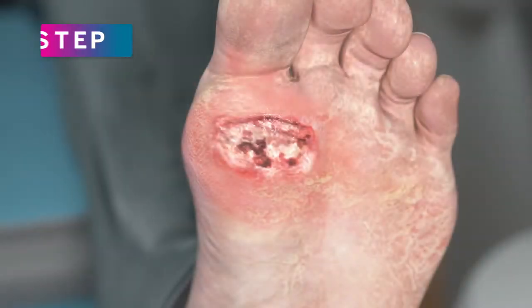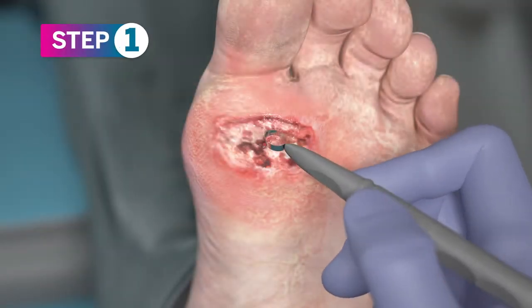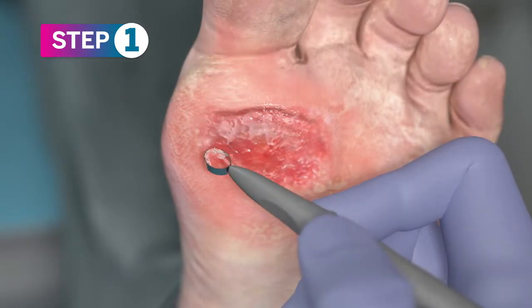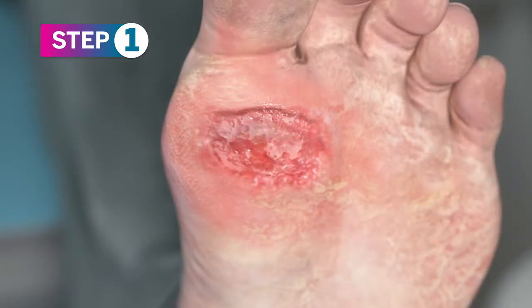It's important to sharply debride the wound, ensuring it is free of debris and necrotic tissue. Make sure the outer rim is flat. Apply PurePly AM immediately.